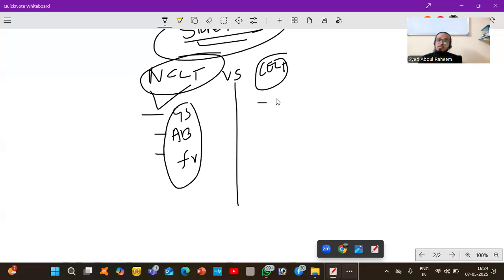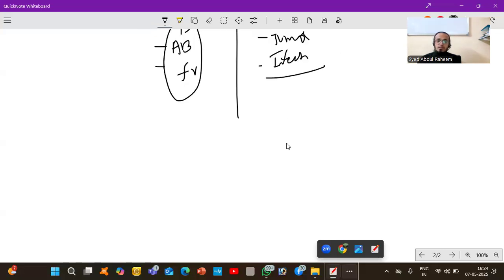If the patient has any inflammation, like irritable bowel, diverticulitis, bowel problems, in that condition you will go through CECT. Inflammation, tumor, any type of tumor, infection: in all these conditions you need to do CECT for the correct diagnostic approach. So you have learned the basic things related to CT scan.